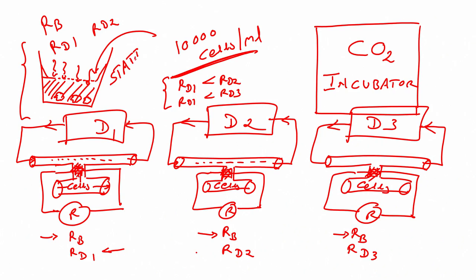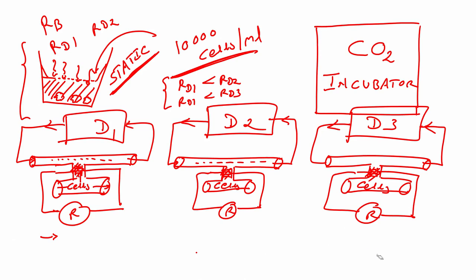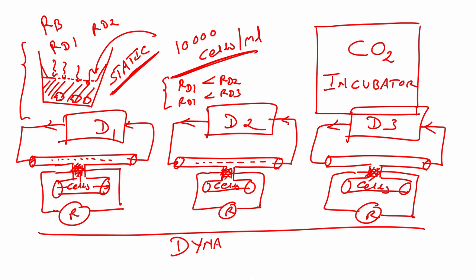Understood? This is just one example out of many on ongoing research in a lot of laboratories around the world, and what we see here is that we can use the platform for drug screening, right. Now, I gave an example here that this is a static platform. If you see the slide, static platform, while all three here, Micro-fluidic 1, 2 and 3, are dynamic platforms. These are dynamic models, right. The Transwell, this one is a static platform.